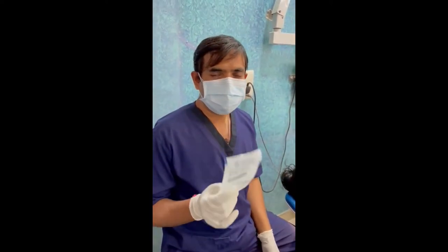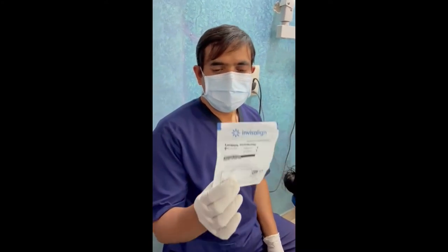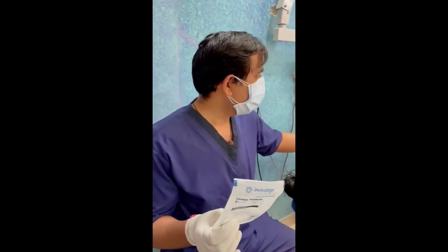For the Invisalign first appointment, we have the most important template. For this template, we have the attachments. What are the attachments? In Invisalign treatment, we have the attachments shown in this chart.